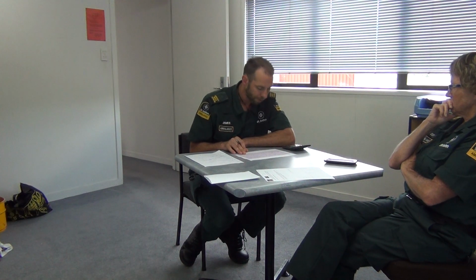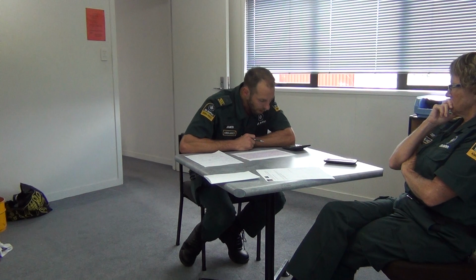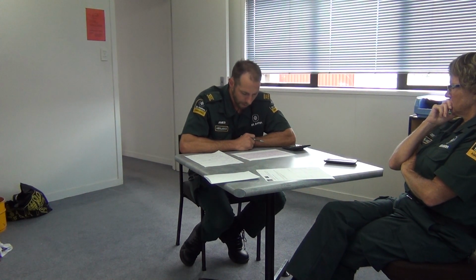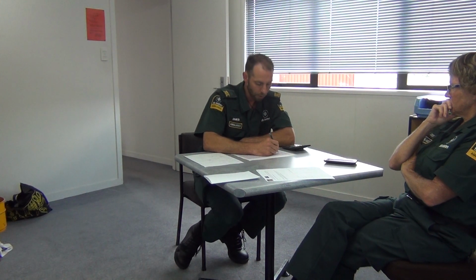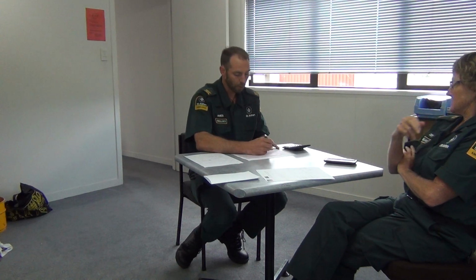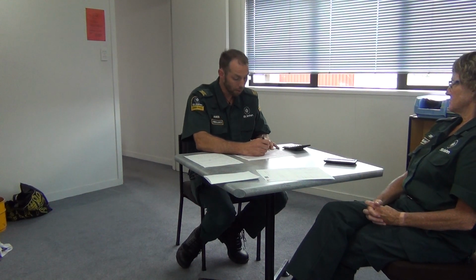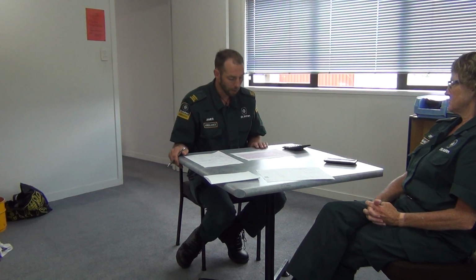Just looking for Q waves, there are Q waves in leads 2, 3, AVF, and that's it. But the Q waves in lead 2 are not a third of the R wave, so that doesn't make them pathological. In lead 3 you've got a QS, as in AVF, you've also got a QS, so there's no R wave. So again, I would say they're not pathological.